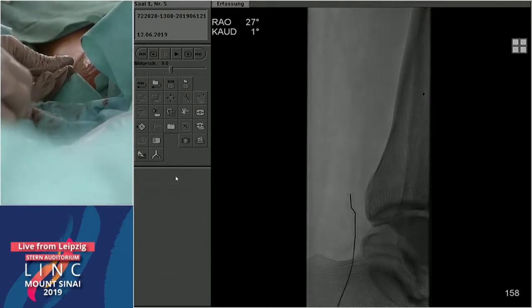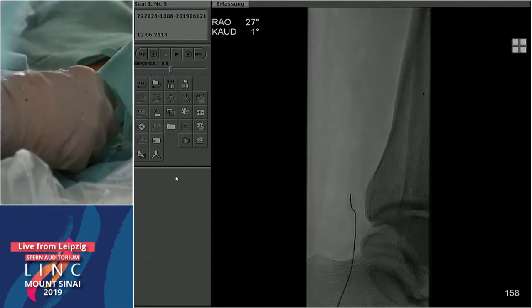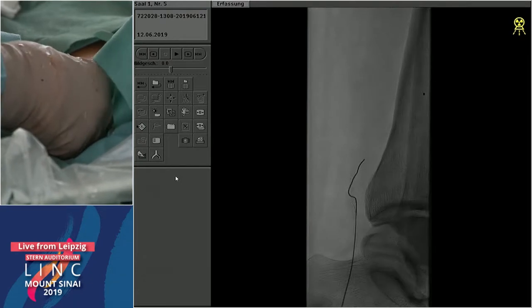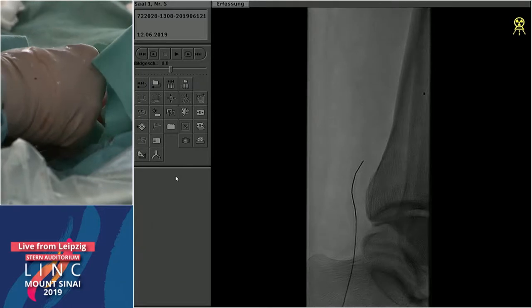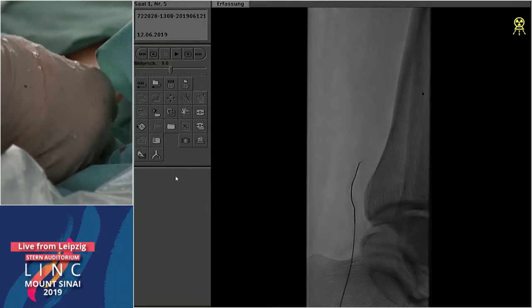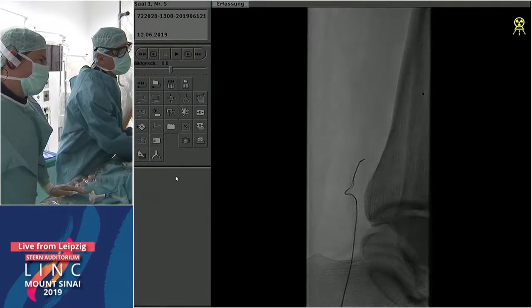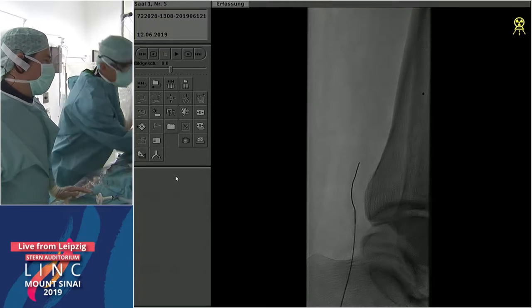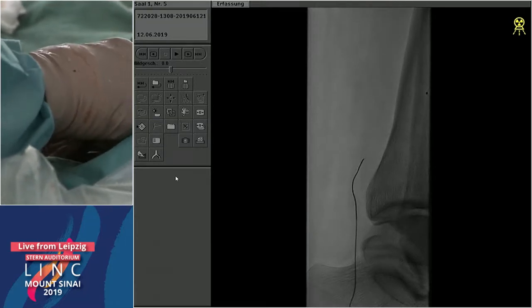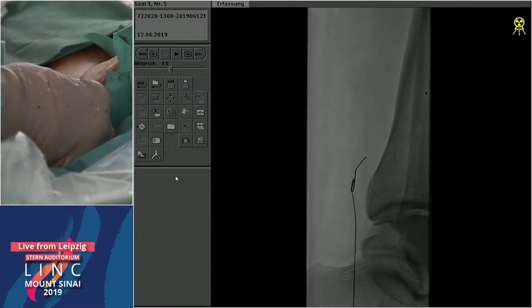A retrograde approach is safer in that retrograde dissection, perforation, or being sub-intimal is much safer compared to an antegrade approach. I would try not to modify the plaque proximally as much as possible until we get lost. The wire looks like it may be looping now. Lift up the foot a little. I'm not sure yet whether to loop — maybe push the dilator in a bit further. Okay — looped. That looks promising!